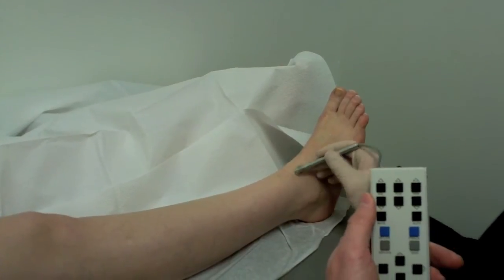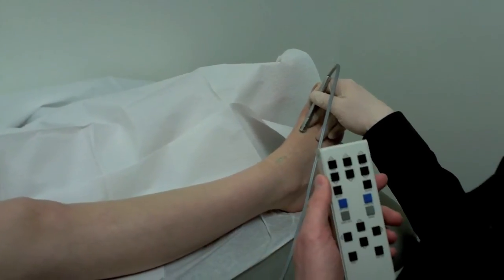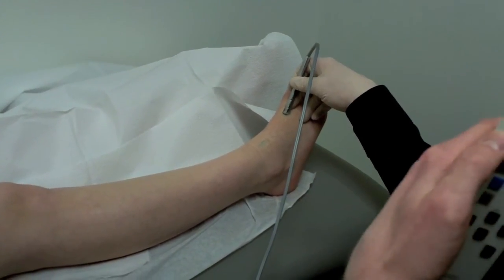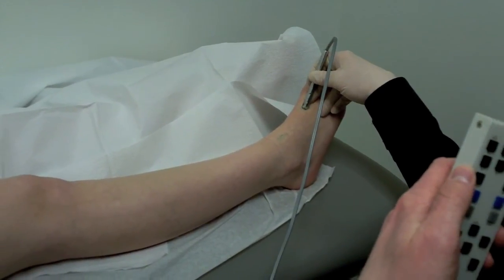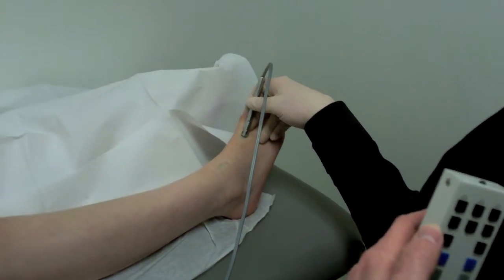And of course, with all these signals, if you have somebody who has some serious disease going on, it's obviously not going to be triphasic, but learning this way on a normal patient and how to listen with your ear, that you've got the best window and the best signal, when you do get those difficult patients, you'll have a much easier time. But the difficult ones are really where you're going to learn even more, but you should be able to get really good signals on patients, especially when they're normal.